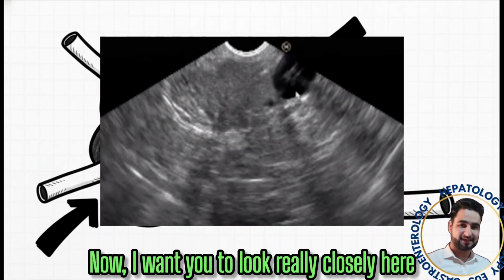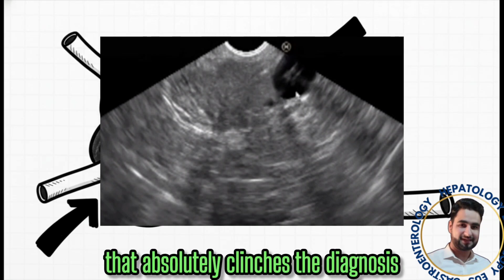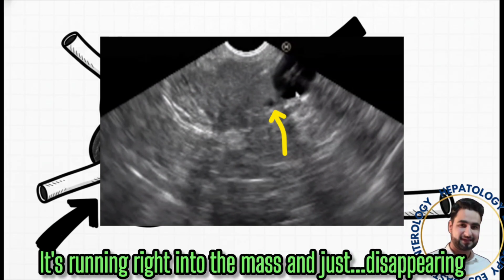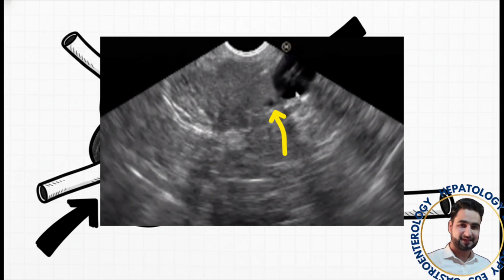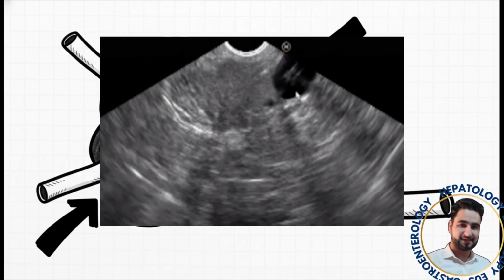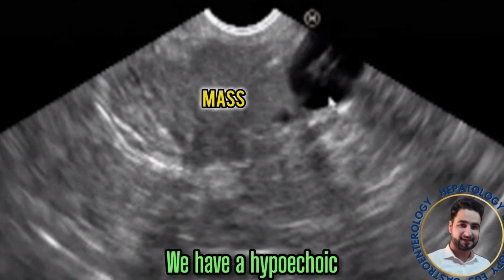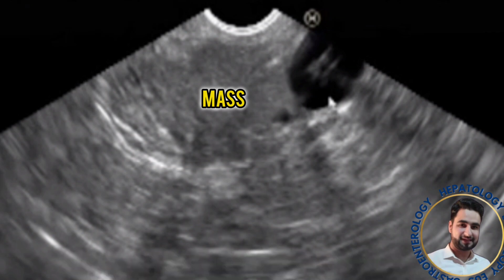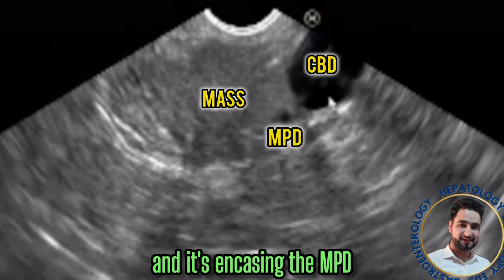Now, I want you to look really closely here. This is the subtle detail that absolutely clinches the diagnosis. You see the main pancreatic duct? It's running right into the mass and just disappearing. This tells us it's not just a bile duct problem. No, this is a periampullary mass, and it's affecting both ductal systems. So, let's put all the pieces of the puzzle together. We have a hypoechoic, irregular mass right in the periampullary region. What's it doing? It's obstructing the CBD, and it's encasing the MPD.